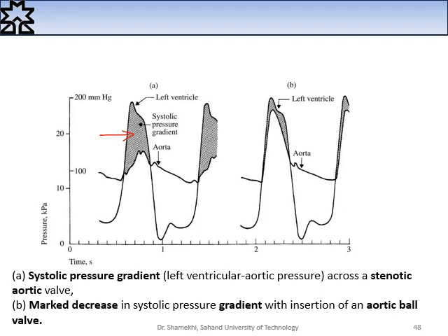And as you can see, the hatched region has been decreased after insertion of an aortic ball valve, or replacement of the aortic valve with the aortic ball valve.